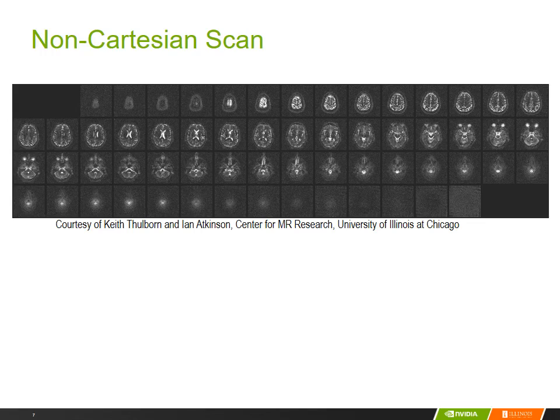Any significant shift in sodium concentration signals potential cell death. So by scanning the sodium concentration map in the brain tissue and observing the shifting of these levels over time, we can tell the trend of tissue evolution in the human brain.